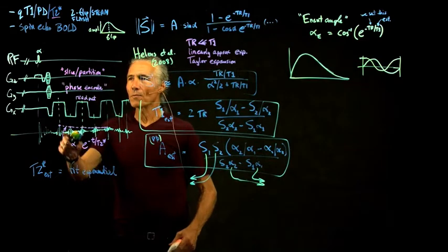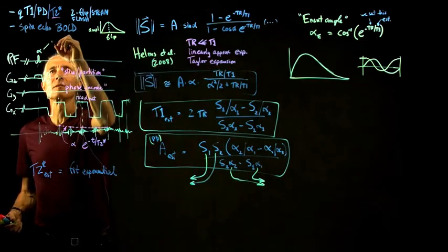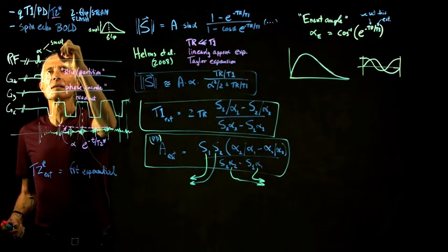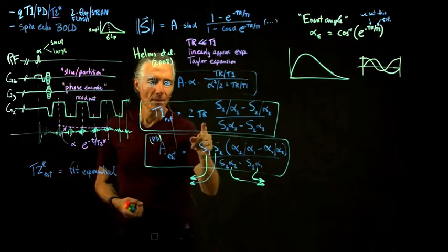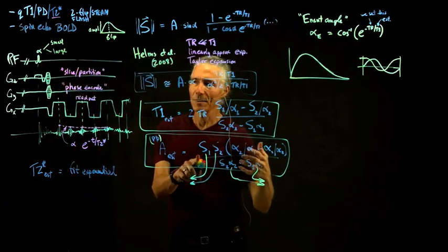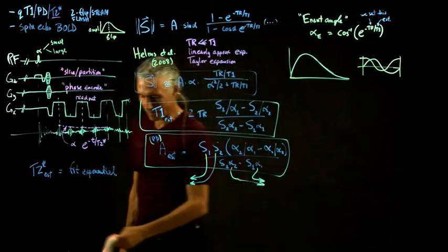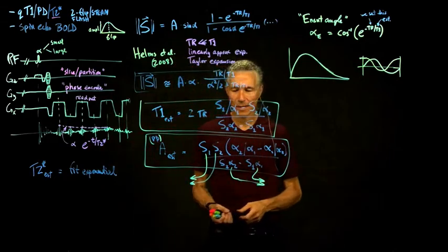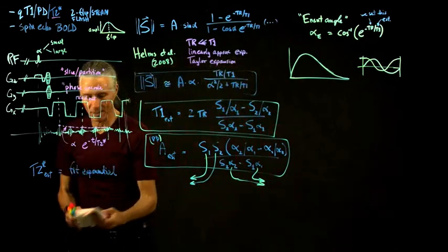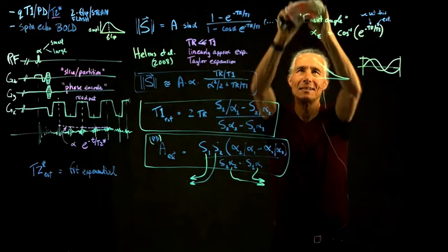And then what we do is we will be doing two different flip angles. So we'll do a small flip angle and a large flip angle so that we have enough data to fit the two signals into that equation at different flip angles. But now we have the problem of the flip angles. The flip angles turn out to be not correct.